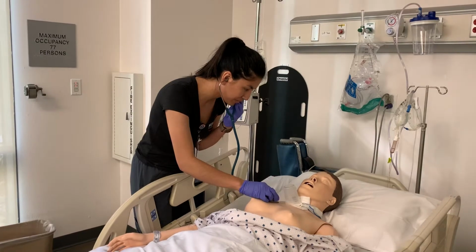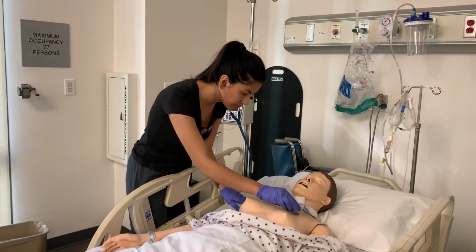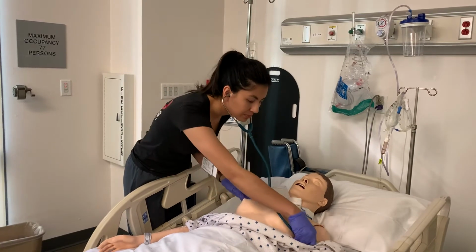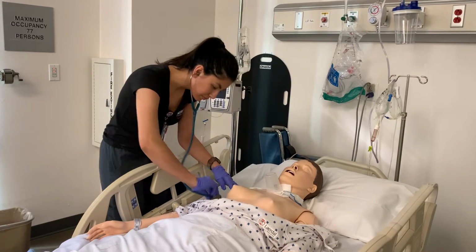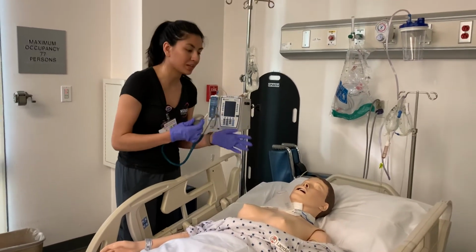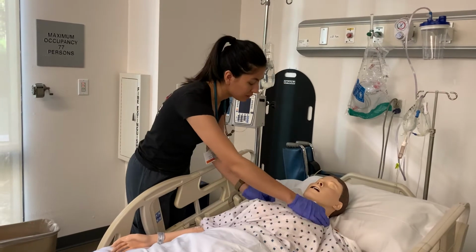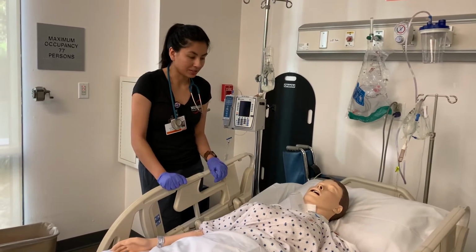So take a deep breath every time I move my stethoscope. Crackles. Crackles. Deep breaths. And I would also have her sit up and I auscultate posteriorly as well. So I heard crackles, and for the purpose of the scale, I'm going to say that's outside of her baseline. So I'm going to go ahead and continue with the suctioning.